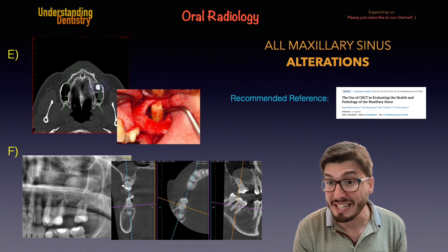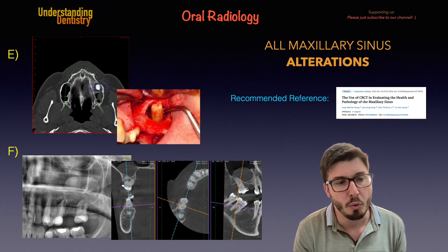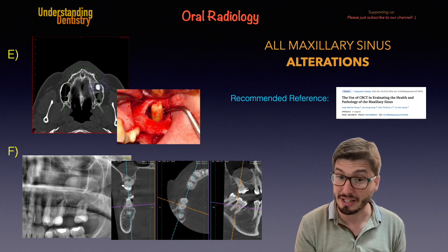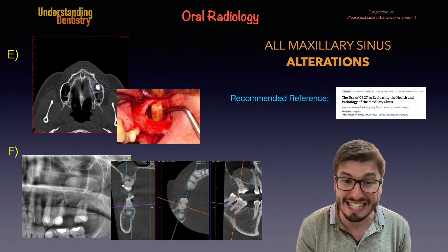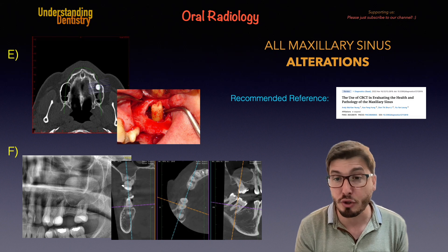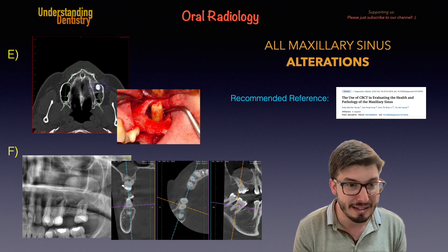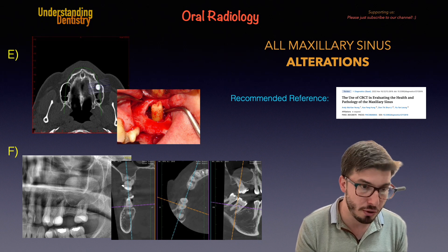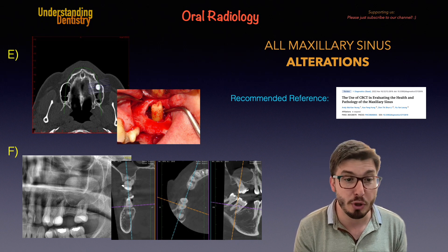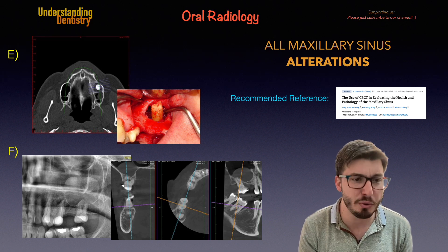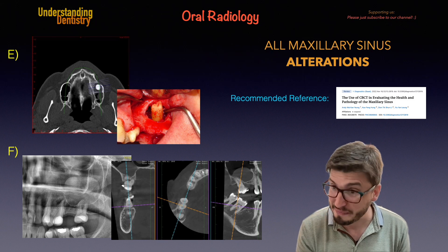Now on the letter F, you are seeing one of the most common alterations of the maxillary sinus, which is the antral pseudocyst — or mucus retention cyst, there are other names — and that's just the dome-shaped lesion. The radiograph is the sole diagnosis required for that; you don't need to do a biopsy. We have a 2D image of one case, and another case on the right side showing an antral pseudocyst in 3D, and you can still confirm the dome-shaped lesion on the CBCT as well.